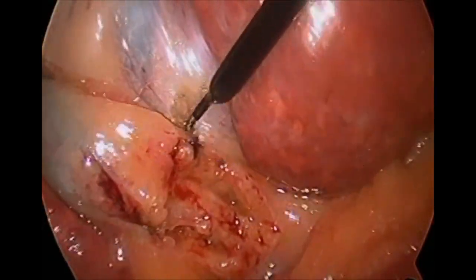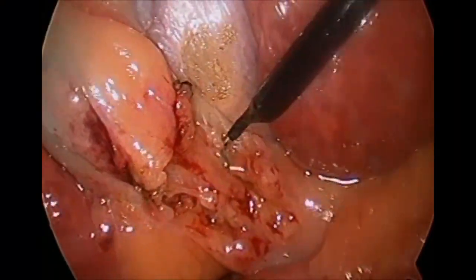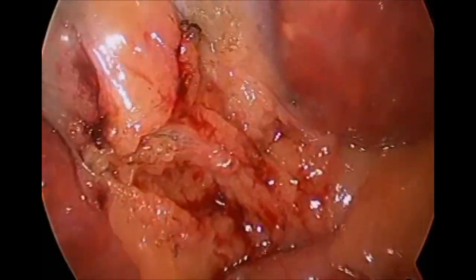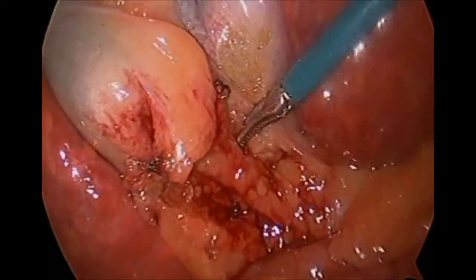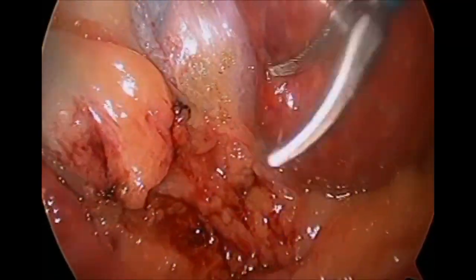Now we are incising the peritoneum over the triangle of Calot and the gallbladder, and we are using a spreading motion to identify the tissue along the correct anatomical tissue planes. We don't use the stripping technique.